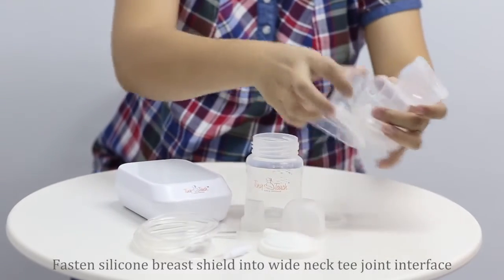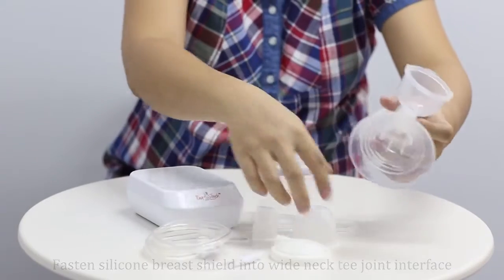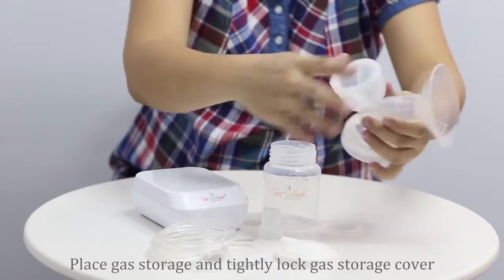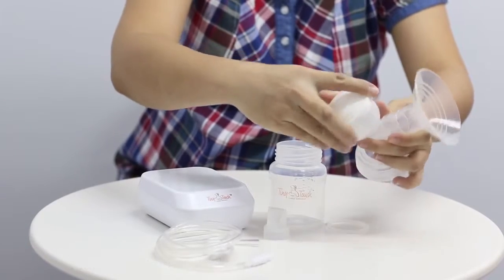Fasten the silicon breast shield into the wide neck T-joint interface. Place the gas storage and tightly lock the gas storage cover.